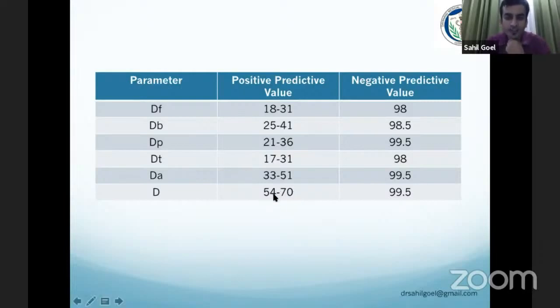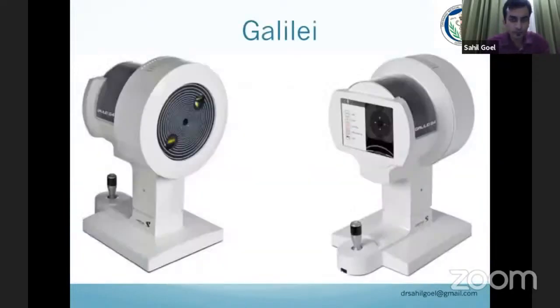But overall D of yellow or sometimes even red, you again have to go back to the quad map or clinical signs, say look for scissoring reflex, look for retinoscopy, look for slit lamp signs to diagnose whether this is a patient with keratoconus or not.